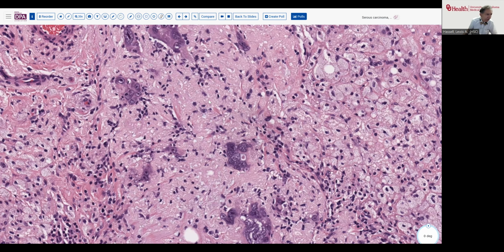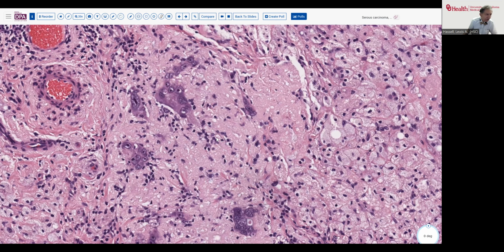Now, if we had waited another 3 weeks or something, would this have been more evident and diminished? We don't know that, but we do recognize that this changes the stage, especially since this was the only focus in the omentum. That makes it a T3. Yeah. And so it's not just a T1 disease, even though it's going to be a Y prefix for post-therapy.